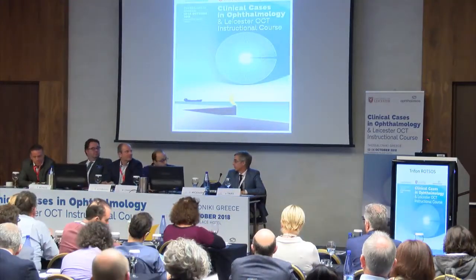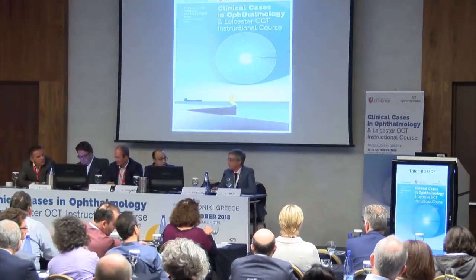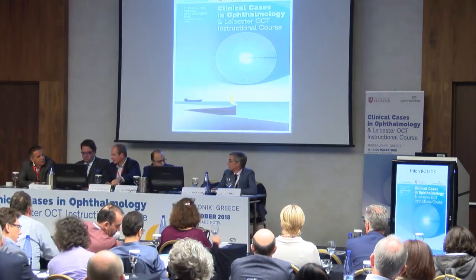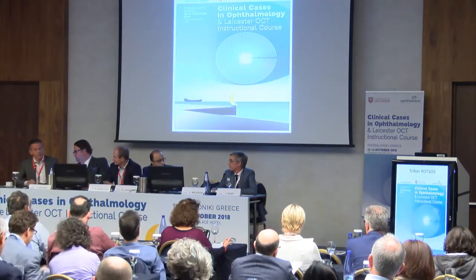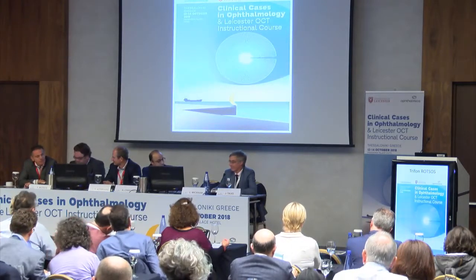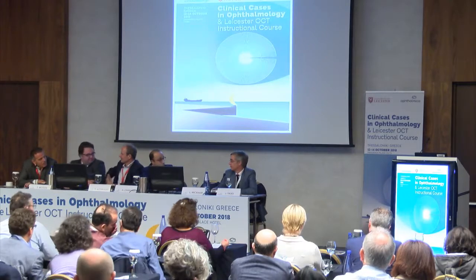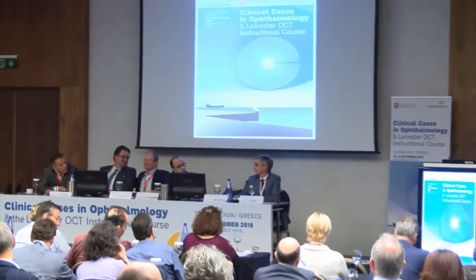I have a question in regards to CRVO. It was disturbing to me that you showed us a patient, I believe, correct me if I'm wrong, with ischemic CRVO treated with anti-VEGF, who stopped anti-VEGF and developed rubeosis about a year after the last injection. That's really disturbing. What I usually do is monitor them closely for neovascularization of the iris for a couple of months or so, following the 3-month rule, which I'm not sure is right now after anti-VEGF. About a year is alarming. That's dangerous, I guess.